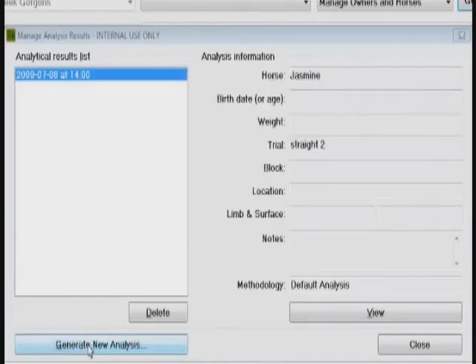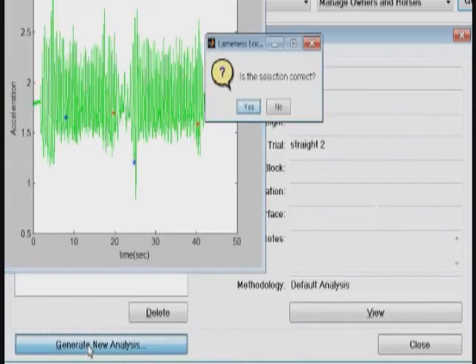Here is a second example. This is another case of data being collected when the horse is first trotting in one direction, turning around and then trotting back. However, in the first segment, the first few strides are not selected. The most common reason for this is that the horse was not trotted off briskly and did not accelerate to approach a median stride rate very quickly.